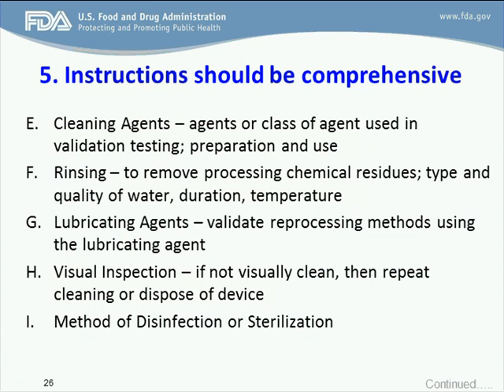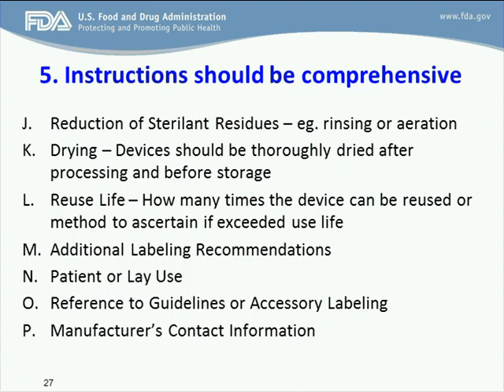You should identify the method of disinfection or sterilization, including the validated cycle parameters and the accessories that should be used. You should provide information on specifications of the device designed to be sterilized and the packaging and load characteristics.